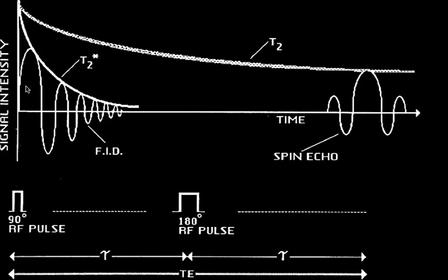But now using very fast technology, you can actually receive signal right after the 90-degree pulse and image off the free induction decay. Some types of ultra short imaging, UTE-type imaging, will image off the free induction decay. And those are obviously going to be T2 star weighted images.